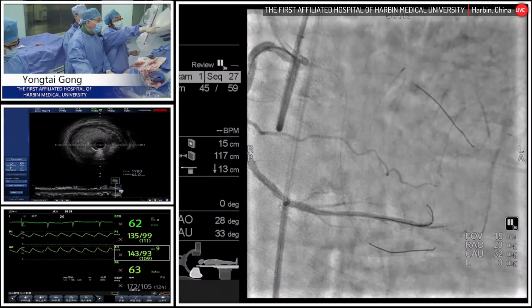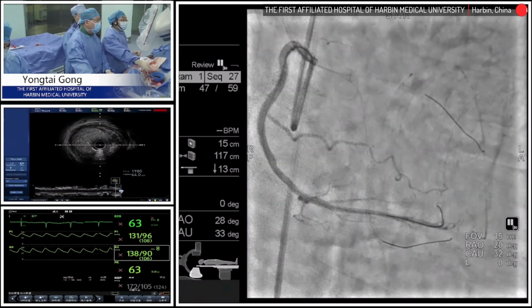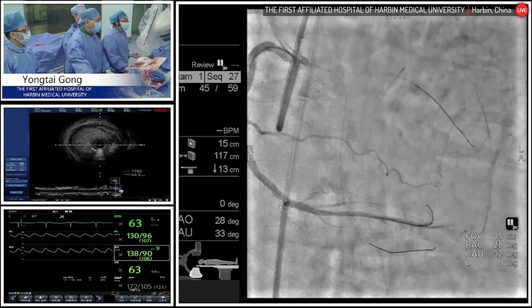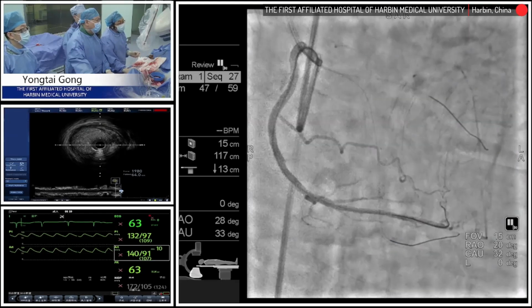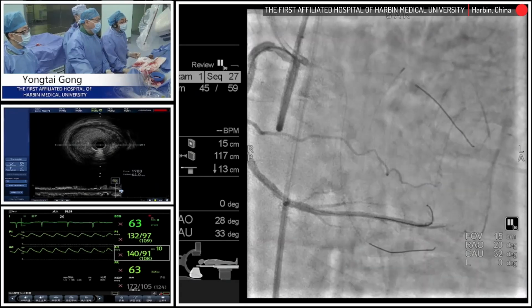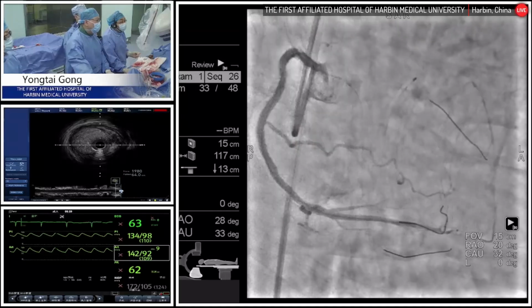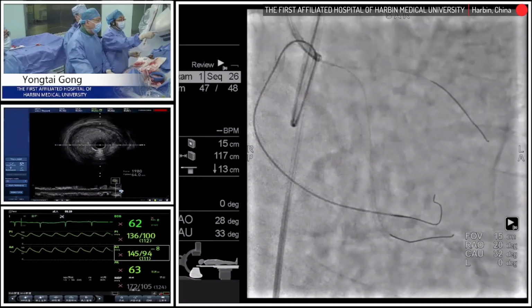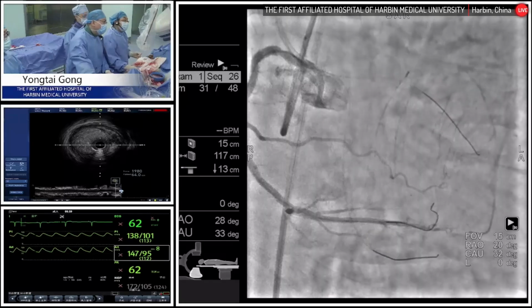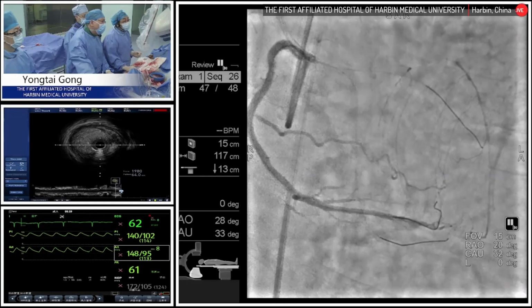We crossed the septal collateral, but unfortunately the retrograde microcatheter cannot cross. Did we try the Caravel microcatheter, or change to another catheter to try? We'll change to another. The proximal one may be a good choice.